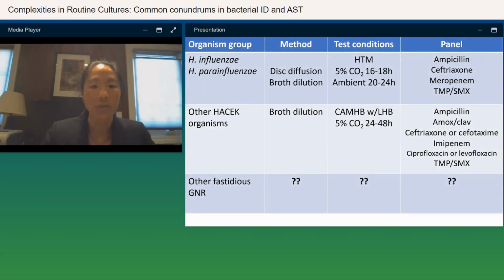Okay, so one of the suggestions was to perform susceptibilities in every possible manner, so we could give them sets of data that they could interpret themselves offline. To which we stood our ground and, very proud that we stuck to our guns, said no. There's many reasons, obviously, for this. Number one is it's not good laboratory practice in microbiology.